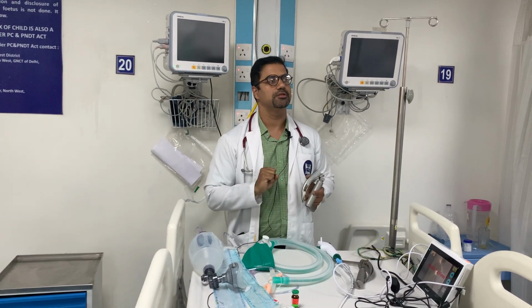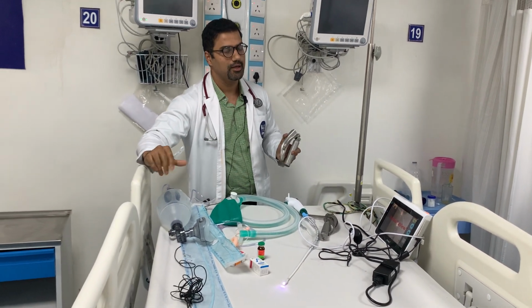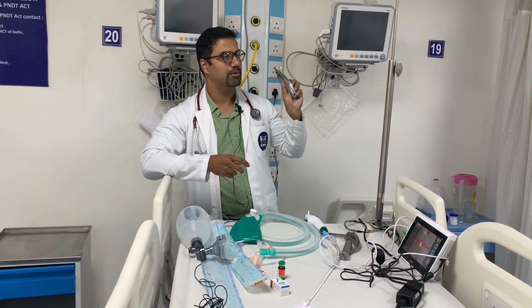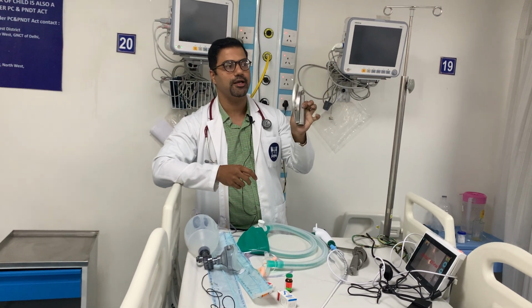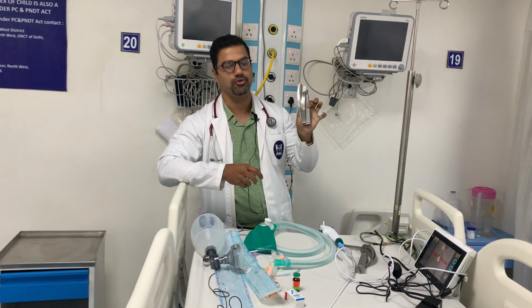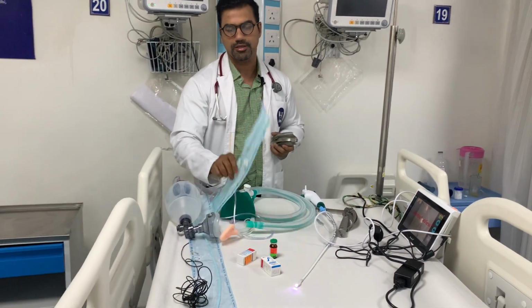Thirdly, your instruments. What is there in your instrument profile? By instrument profile, I mean this is only a laryngoscope. Many times it will happen that the tube does not go with an isolated laryngoscope. You need some other accessories to get the tube in. So you have to check whether you have got a stylet or not.